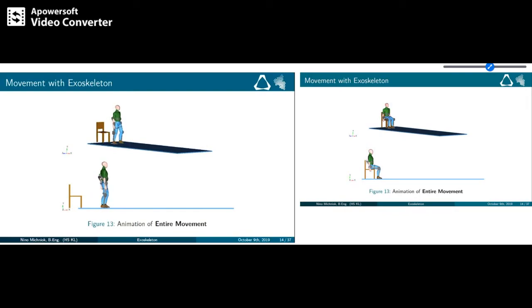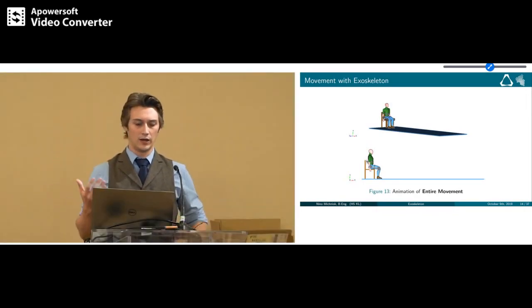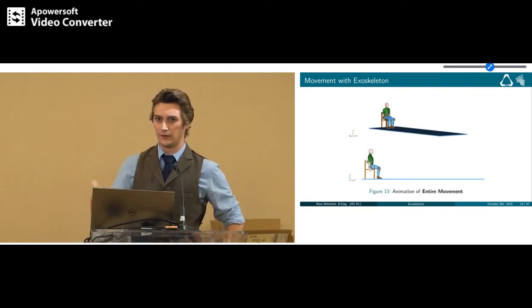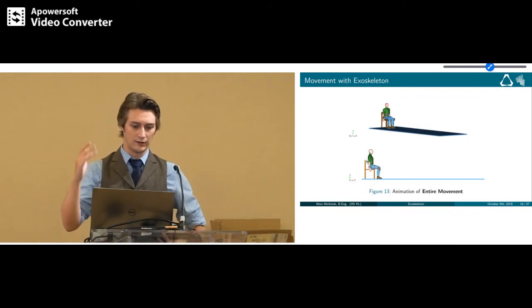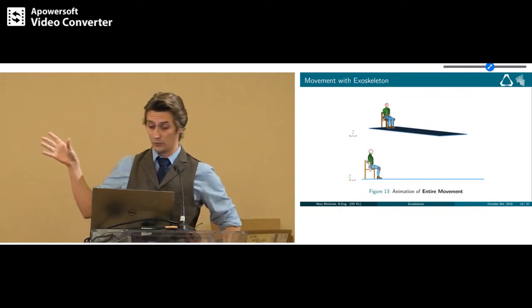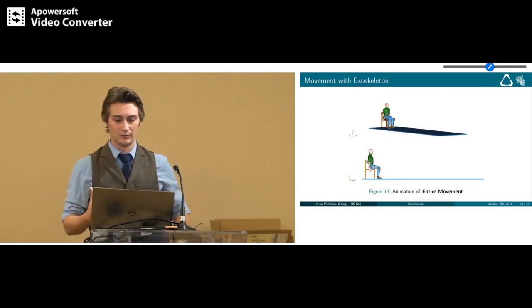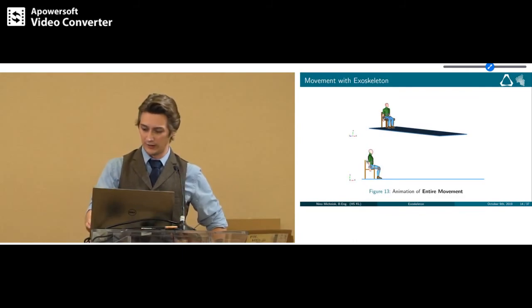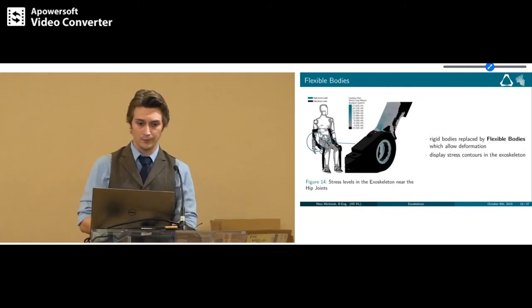And the second thing which caused the errors were the discontinuities in my motions, because I worked with sensor events at that time. For example, in the beginning, my dummy was able to lean forward to get its center of mass near its feet to stand up properly. And when it reaches a vertical upper position, the sensor event detected it and set a constraint. This worked in the first model pretty fine, but didn't work when I used the flexible bodies. So what I did is I just exported the angle displacements again, adjusted them a little by hand to have a continuous motion, which I then could use to add flexible bodies to the model.